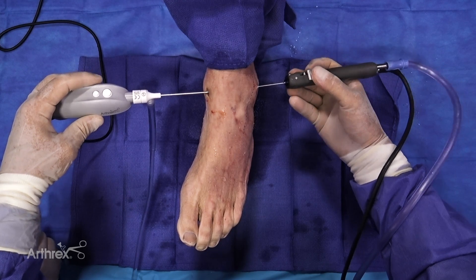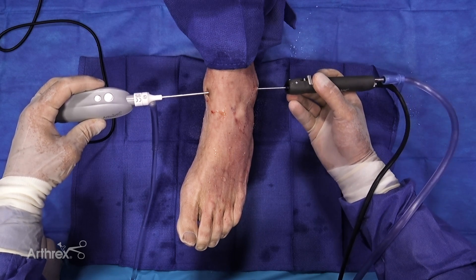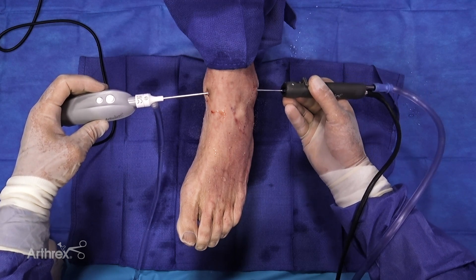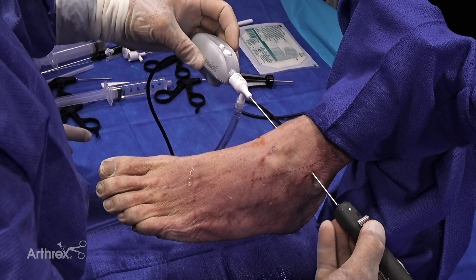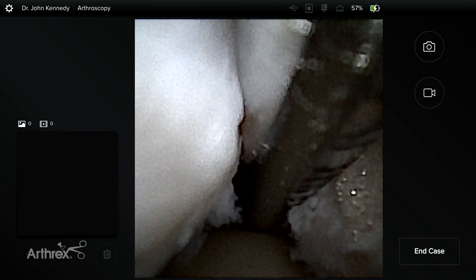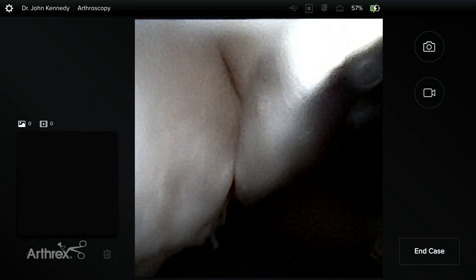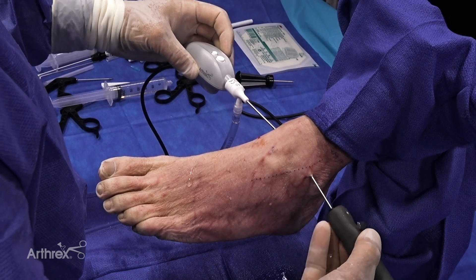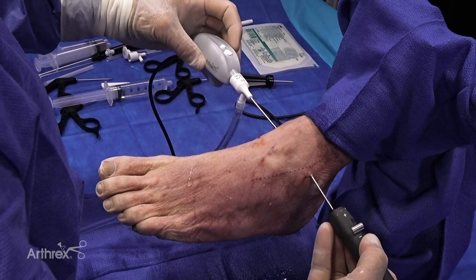You can see with this nanoscope the ergonomically designed handpiece — it's so light. There are no multiple cables coming out of this. It's very easy for me to use my finger to take a picture without having to change the position of the unit itself. Overall, this is just very easy to use and certainly not fatiguing in any way. All of this is done under local, and the patient is watching. I think that's very important for the patient to understand and to buy into what their pathology is. When they see this under the scope, they understand much better about what their pathology is and what their recovery will require, rather than just looking at an abstraction on an MRI.